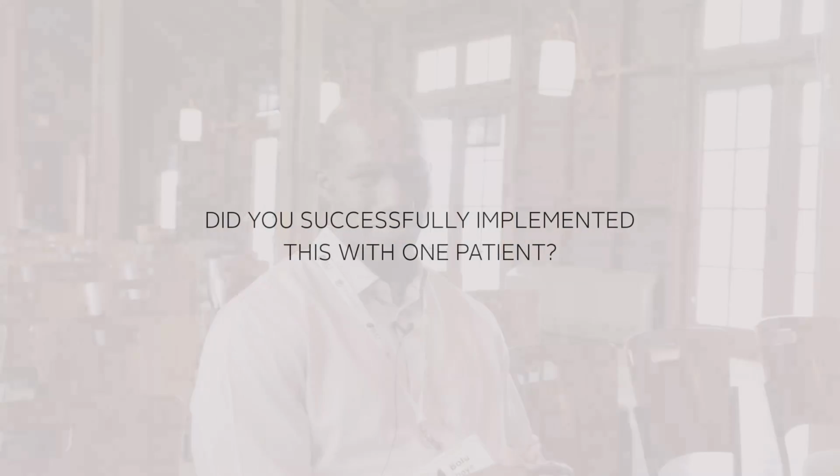Because typically with movement, the brain sends a movement command which goes through the spinal cord, but with the spinal cord injury, that movement command can't get to the peripheral muscles and nerves. So with the BCI and FES, we have now gone around the spinal cord such that a person with paralysis can now think about moving, and then the arm and hand will move in the same way that they're thinking about.